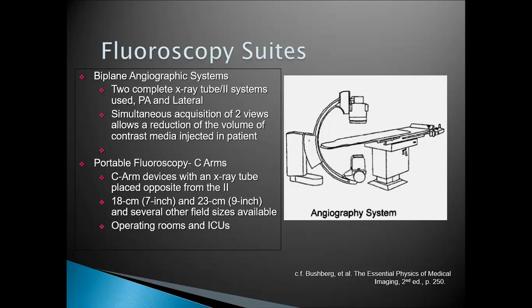Now the portable fluoroscopy, which you have in so many institutions, the C-arm. So an example of a C-arm. You can see the shape, C. So that's why it is called C-arm. Very portable, and we use it for some limited interventions, and not the very complicated ones that would need a dedicated fluoroscopy machine. So this one can make do with so many interventions.